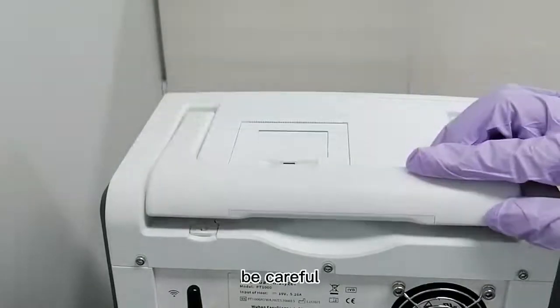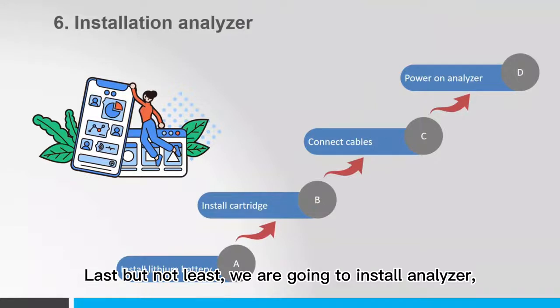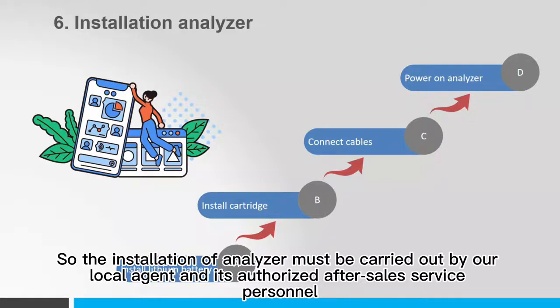Note — be careful. Last but not least, we are going to install the Analyzer. Non-professional personnel may damage the Analyzer during the installation process, so installation must be carried out by our local agent and its authorized after-sales service personnel.